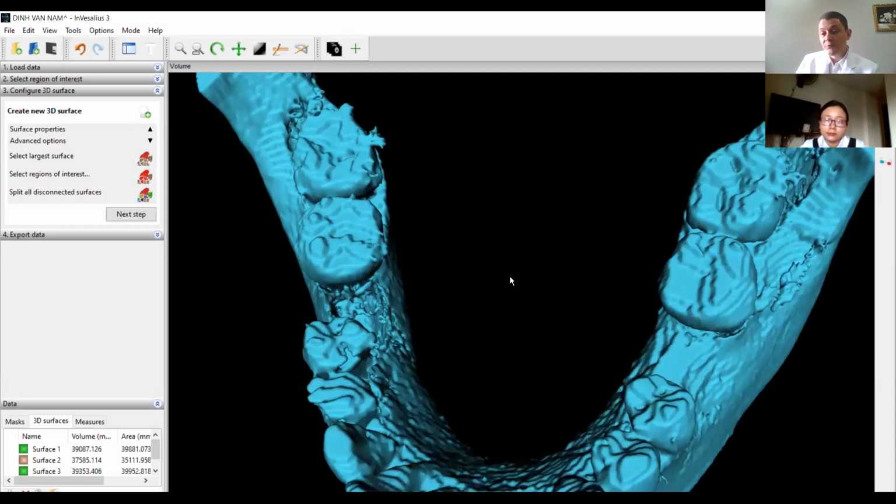Okay, or same for implant. Let's say it's your first implant. You want to train in the same situation as your first patient. Take a CBCT, you take every slice to have a very good definition. You 3D print the mandible, and after you put your implant in the replica of the patient.